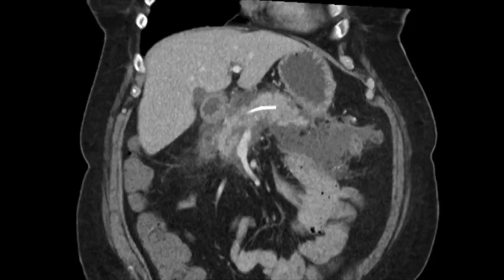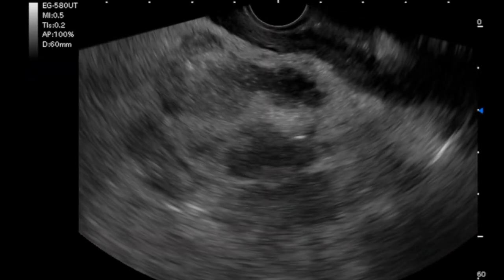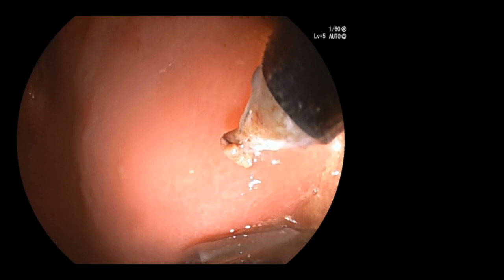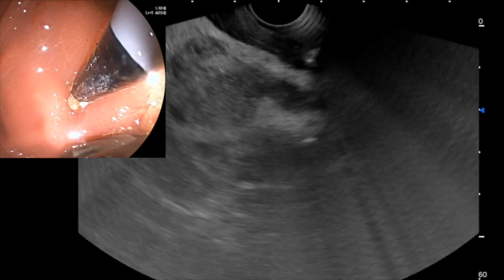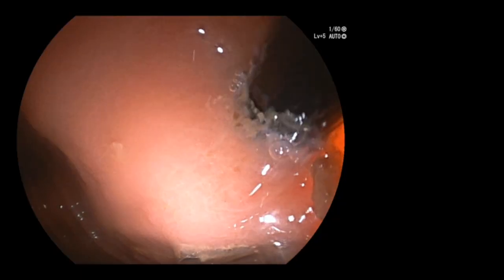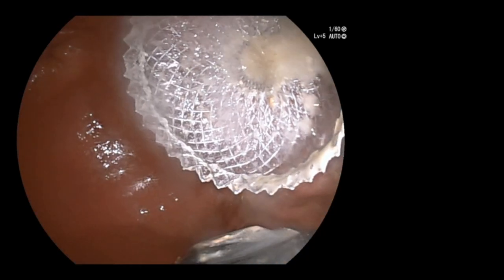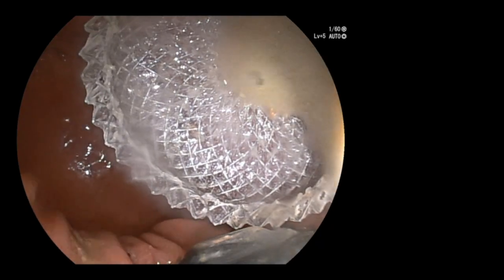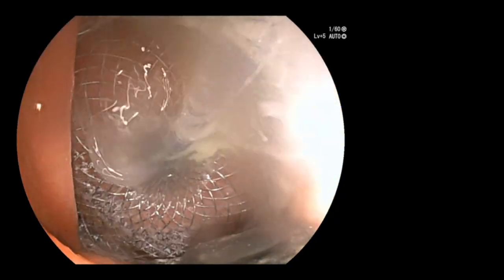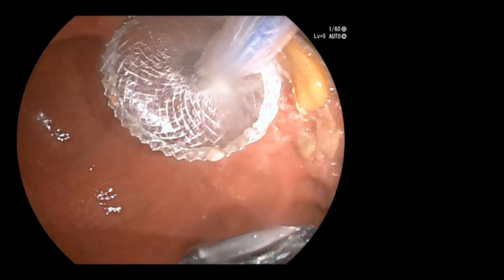In a 51-year-old patient with an acute necrotic collection, EUS-guided drainage was undertaken due to ongoing severe sepsis. An optimal site was identified in the distal stomach on endoscopic view. After puncturing the collection with an electrocautery-enhanced delivery system, a 20mm diameter lumen-apposing metal stent was deployed. Note the excellent intra-procedural endoscopic view during stent deployment and post-deployment. The position of the instrument channel in relation to the camera lens enables seamless performance of interventions such as irrigation of the necrotic cavity and subsequent dilation to perform direct access endoscopic necrosectomy.